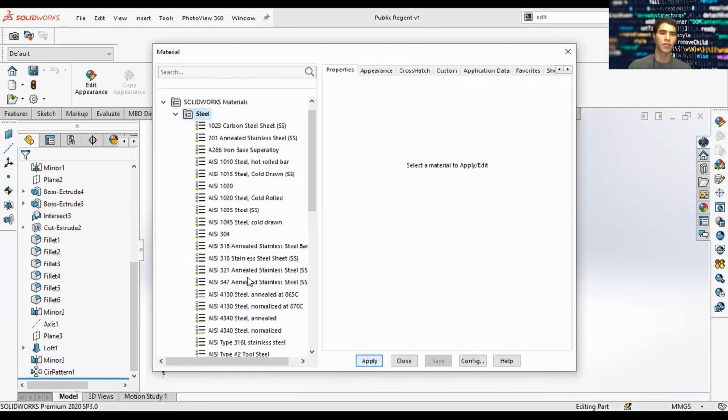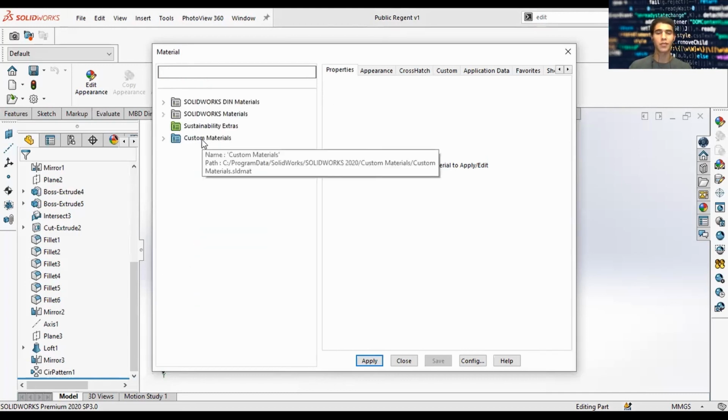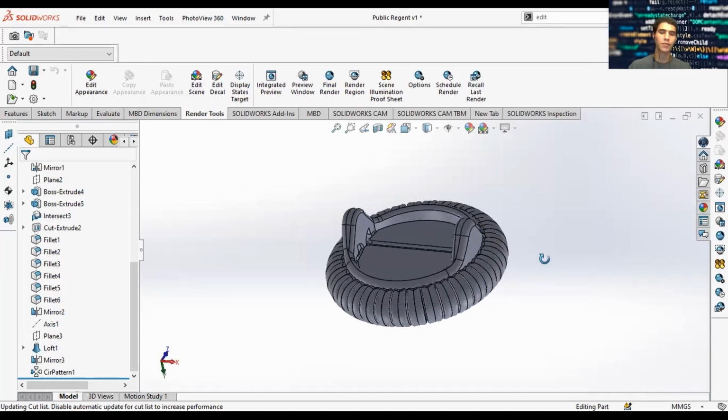and it should create a database of everything available. Carbon. You have carbon steel, plain carbon steel, pyrolytic. Yeah, it's not available. So pyrolytic carbon is not available. What you would do is you would create a custom material, and you would fill in specific requirements for that material, such as Young's modulus, all the different requirements. But that will be for a different session.